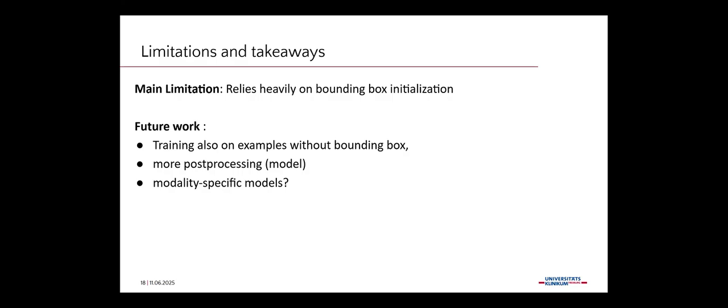So the limitations, I think, really are this problem with the cases without bounding box. I don't know if this information is available now, how much this actually exists in the testing set, and whether this is a reason for a drop in performance for us on the test set. But definitely, I think we need to deal with them a bit differently, maybe also incorporate them during training. We didn't incorporate any examples without bounding box in training, I think.